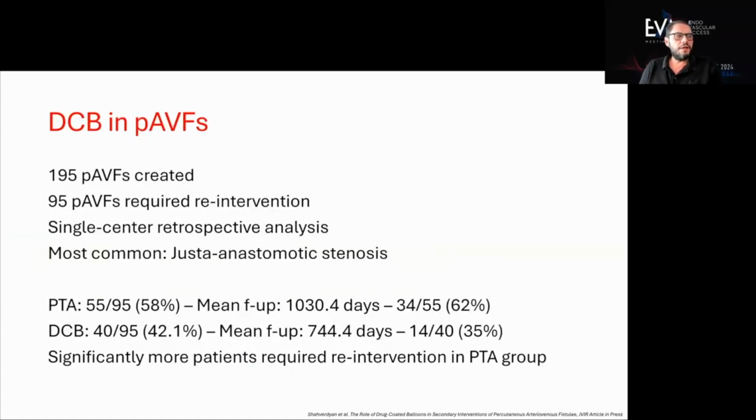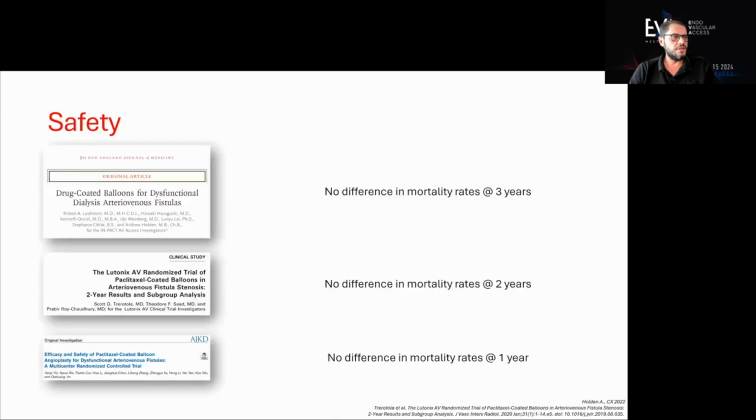There's also an excellent study from one of my friends and colleagues who is with us in the panel today, Dr. Shaverdian, who was the first to test drug-coated balloons in percutaneous fistula. He also showed that significantly more patients require reintervention with a PTA compared to drug-coated balloon groups, in this single-center retrospective analysis, and I'm sure he could give you an insight into this study as well.